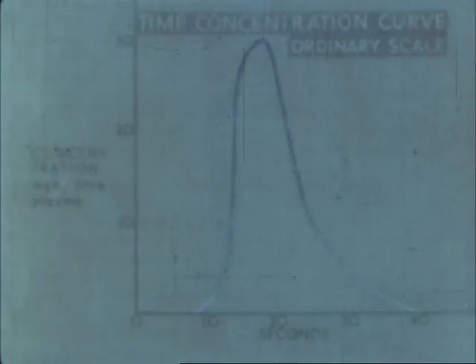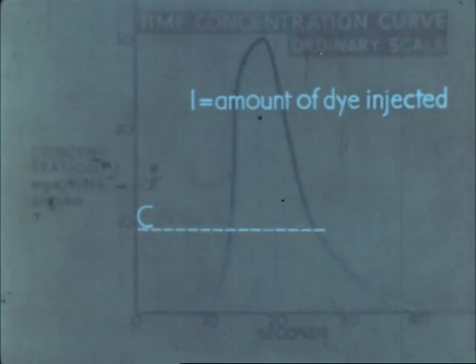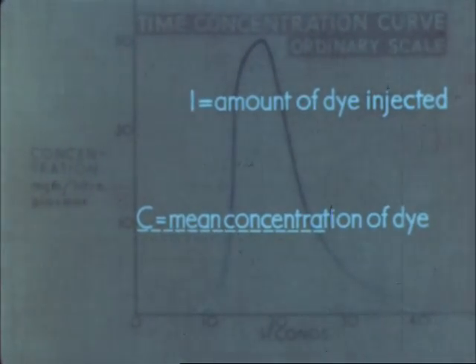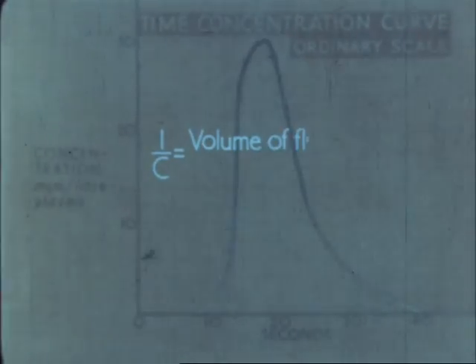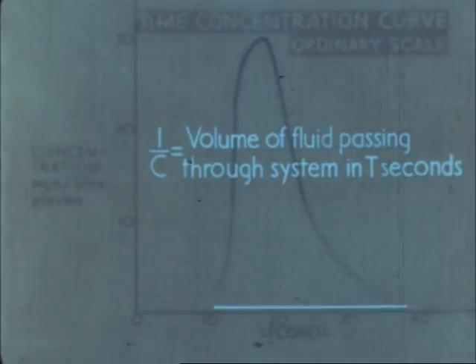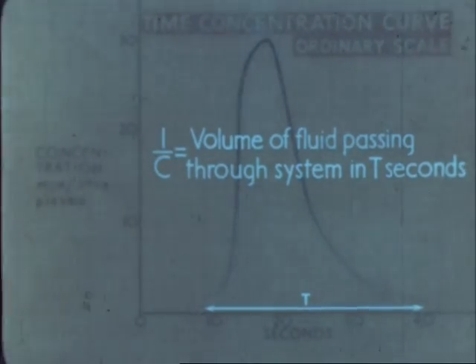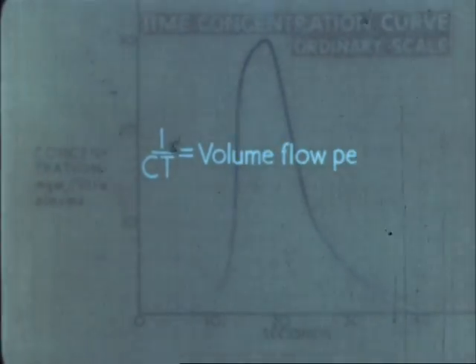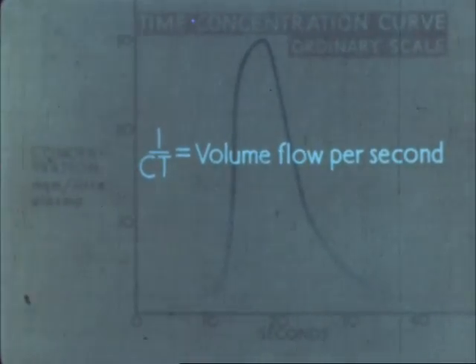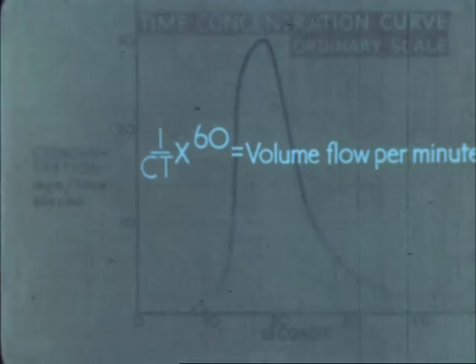Suppose capital I represents the amount of dye injected. From mathematical analysis of our curve, we can estimate the mean concentration of the dye, C. The amount of injected dye divided by its mean concentration will be the volume of fluid passing through the system during the time t. The volume flow per second will therefore be I over Ct. And the cardiac output per minute will be I over Ct multiplied by 60.